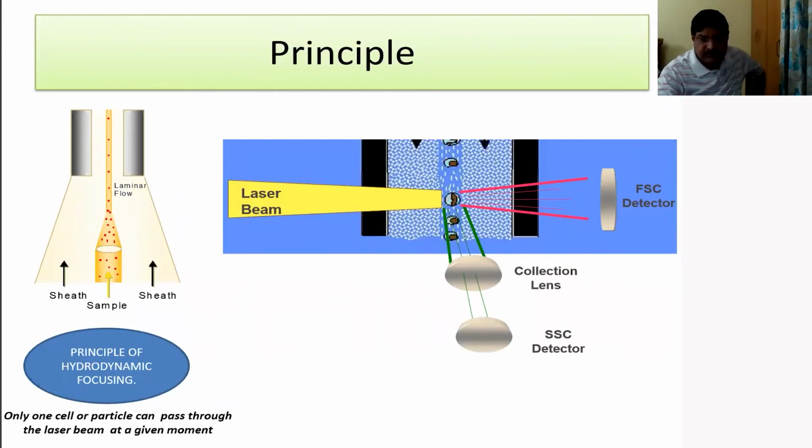And this is also the principle of many of the cell counters these days. And when the cells flow through these linear apertures and the laser beam falls on it, it produces the forward scatter, and they have photomultiplier tubes and detectors, and collecting lenses. So they will produce two-dimensional plots like forward and side scatters. Next, please.